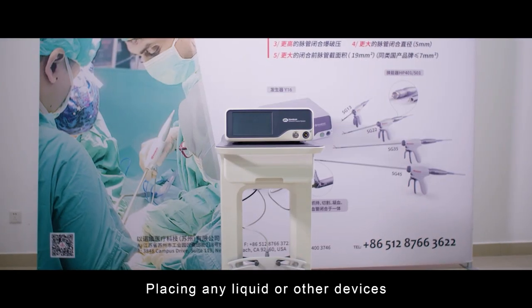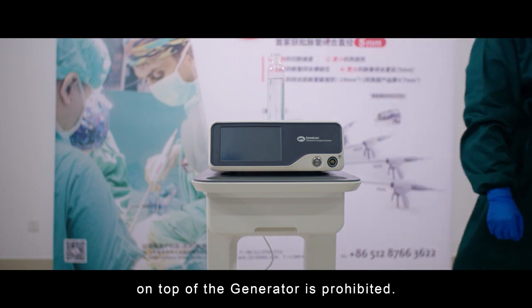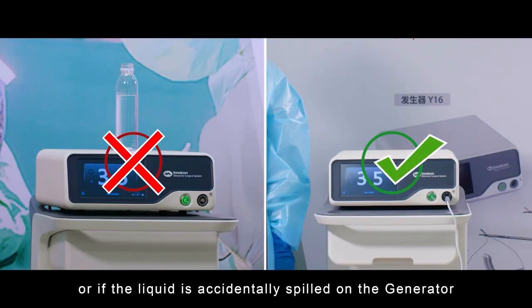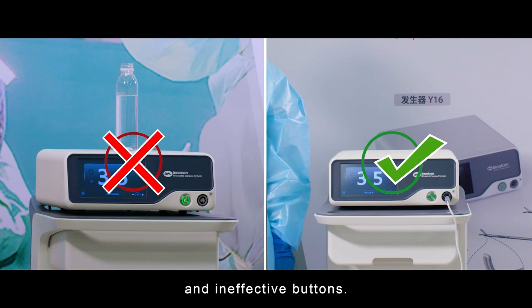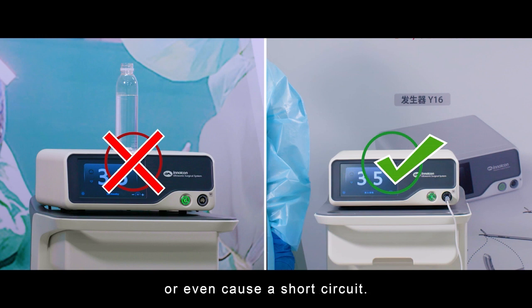Risk warning. Generator. Placing any liquid or other devices on top of the generator is prohibited. If the generator is squeezed or deformed during transportation, or if liquid is accidentally spilled on the generator, the screen may be damaged, resulting in an incomplete display and ineffective buttons, or it may damage the outer packaging, depainting or corrosion, or even cause a short circuit.